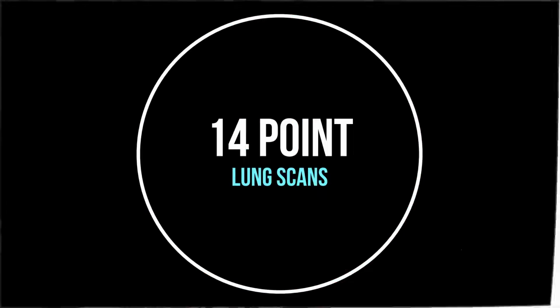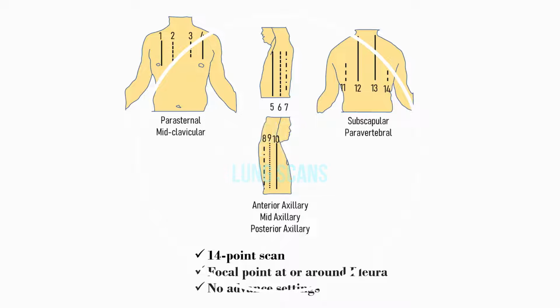That's where the proposed approach or proposed package comes into the picture, and I would like to explain this in 3 steps. The first important step is the 14-point lung ultrasound scan. The 14-point lung ultrasound scan is something which is established by the clinicians in the team, and it is extremely important because the lung is a fairly large organ covering both sides of the body. So we have identified 14 points where the lung ultrasound will be performed, and each of these 14 points will contribute to a video. This covers the entire spectrum of the lung.